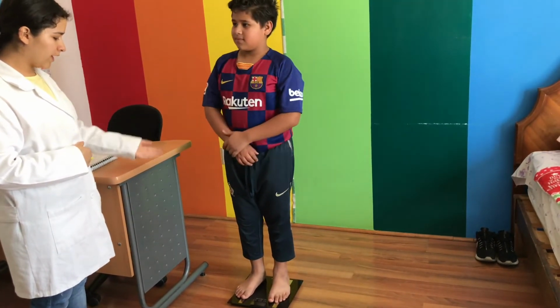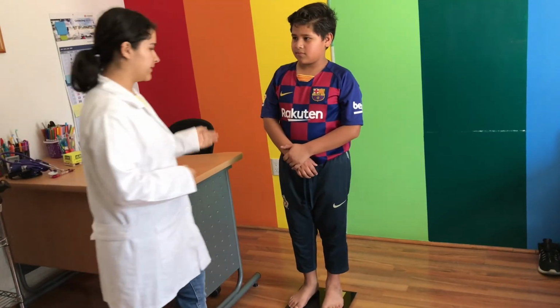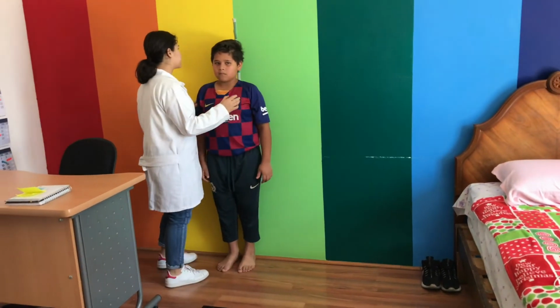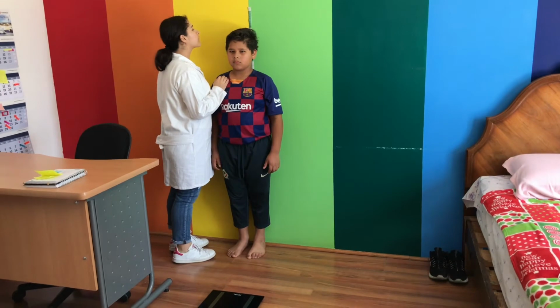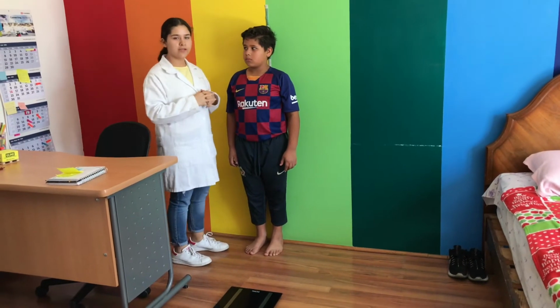So his weight is 49 kilograms. Now we're gonna go on to the height. His height is 140 centimeters.